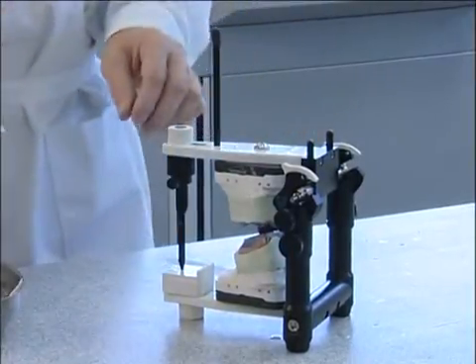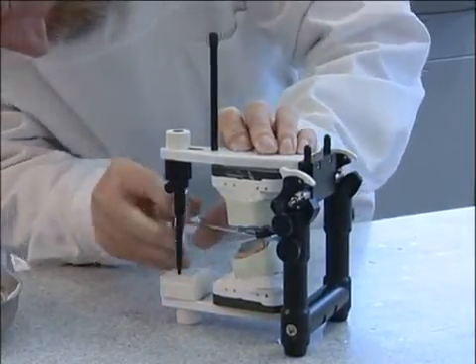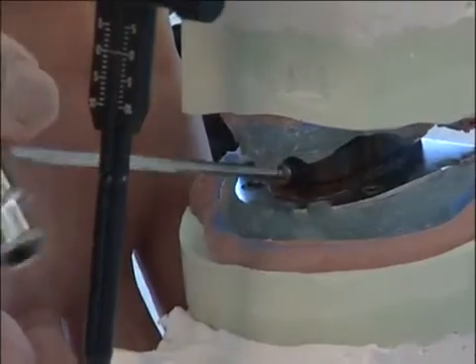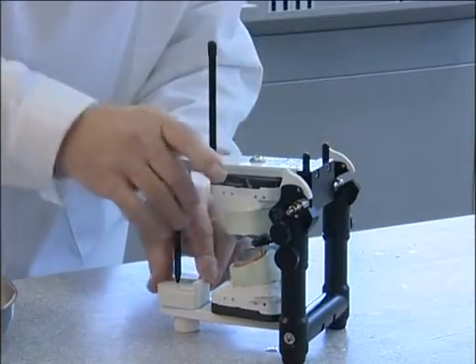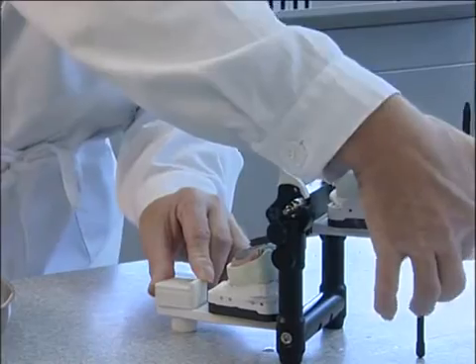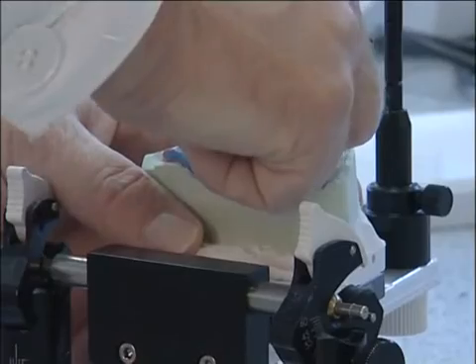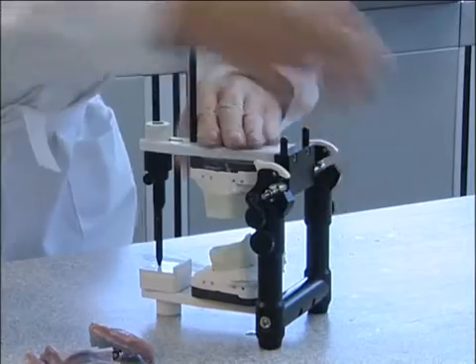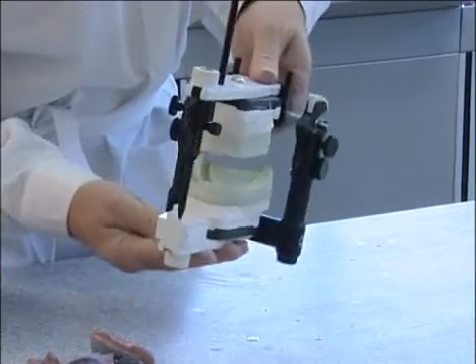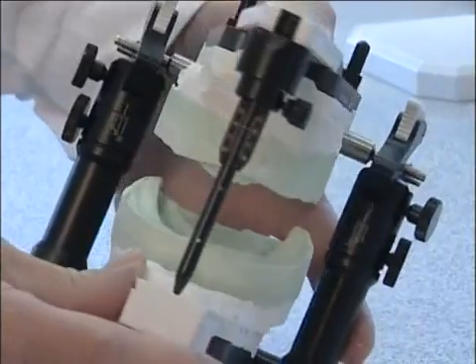After hardening, the tracing ball of the CentroFix registration is released and the centric lock of the articulator opened to allow the ball to release smoothly from the pin holder when the articulator is opened. The functional trays are removed from the models, which now coincide exactly with the physiological status of the patient. That is, the cranium axis and jaw relationships, as well as the vertical dimension. This provides the dental technician with optimum conditions for fabricating perfectly functioning dentures.